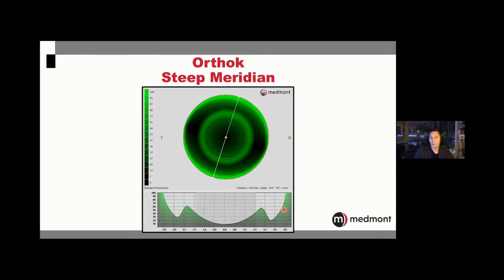What I should be doing now is reconstructing the lens for a toric landing so that we create a better relationship of this section of the lens. So we land at 6 o'clock, we land at 12 o'clock, we create 360 degrees of alignment with the cornea. Now, can you imagine if we would have fit this lens to the patient, what would be the outcome?